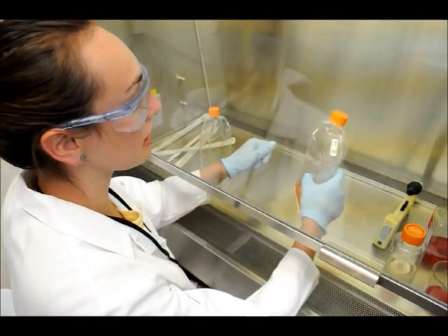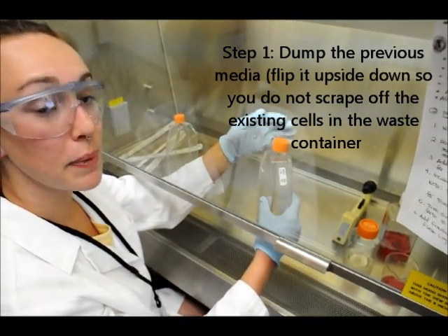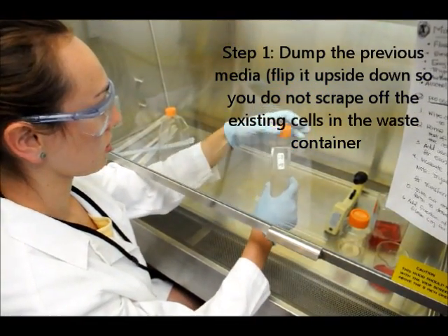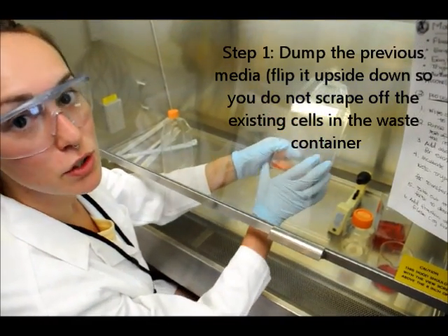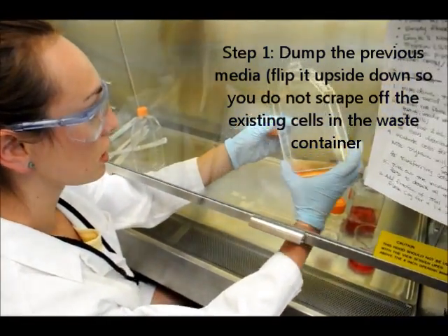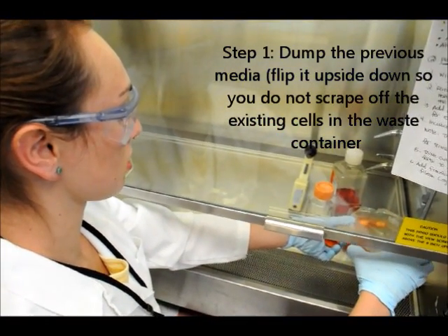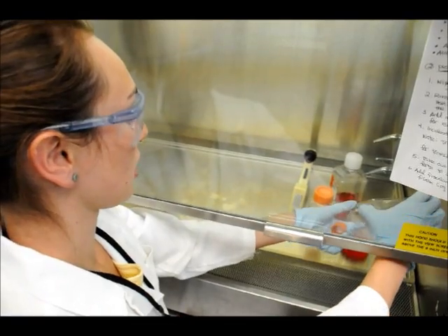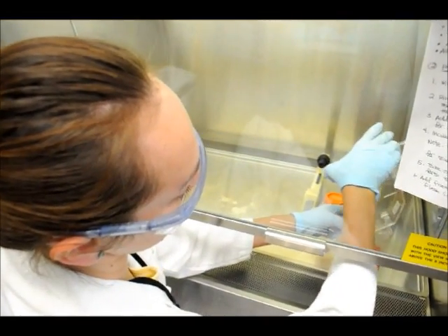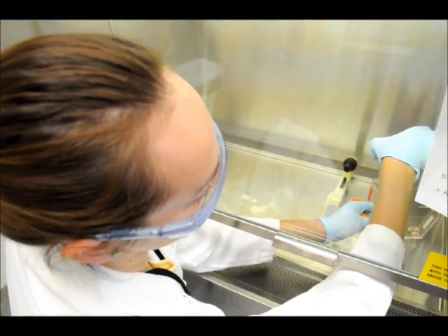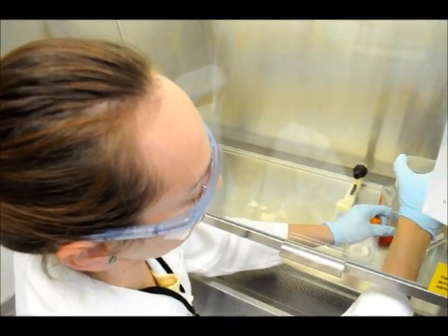First you're going to take the media, the cells that you're going to split, and you're going to dump out all the media in it. Make sure you do it with the actual cells at the top so you don't get rid of any of the cells. Dump it out carefully and make sure you get it all out from the sides.